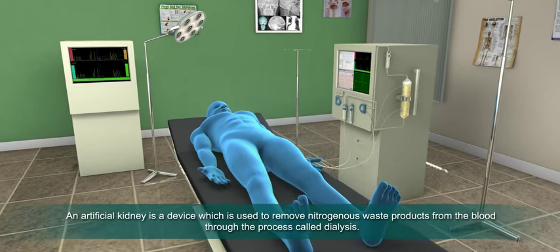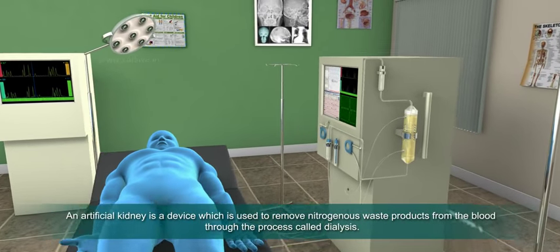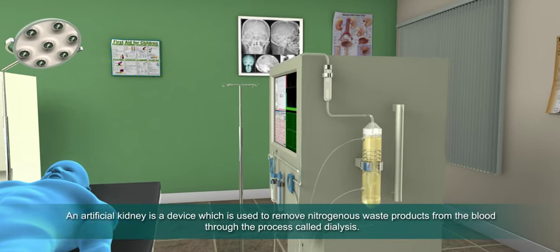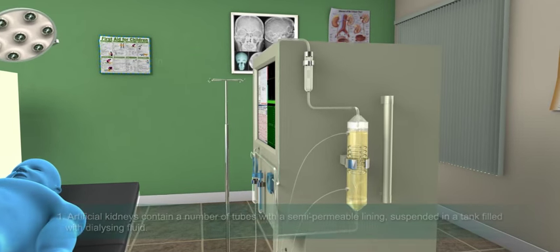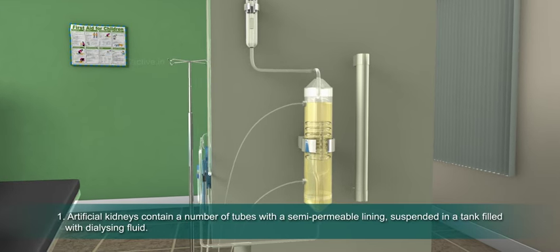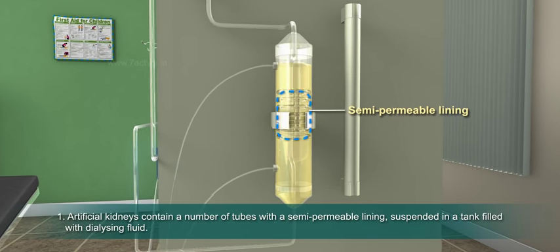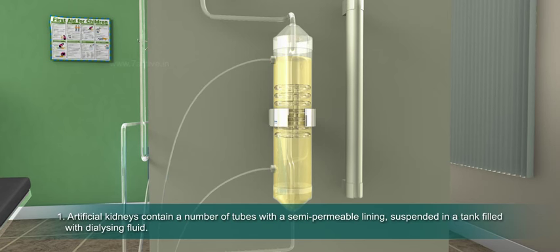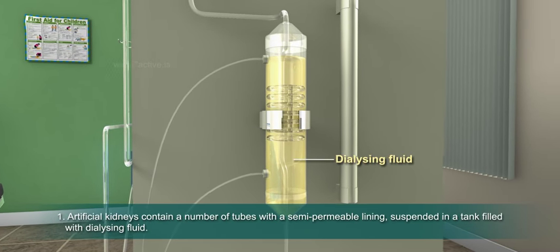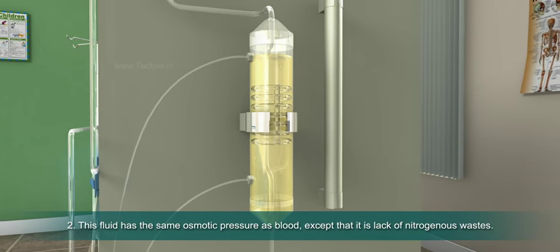An artificial kidney is a device used to remove nitrogenous waste products from the blood through the process called dialysis. An artificial kidney contains a number of tubes with a semi-permeable lining suspended in a tank filled with dialyzing fluid.